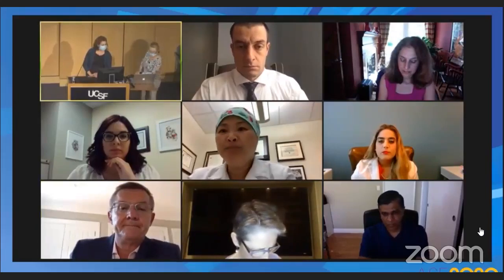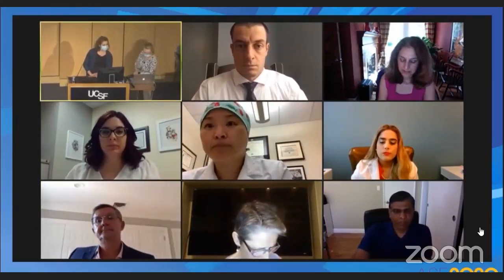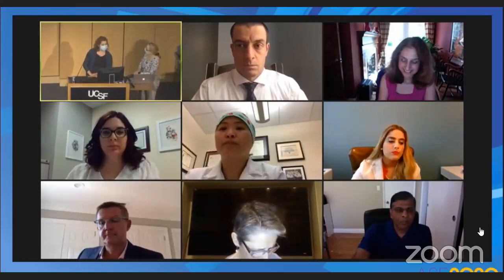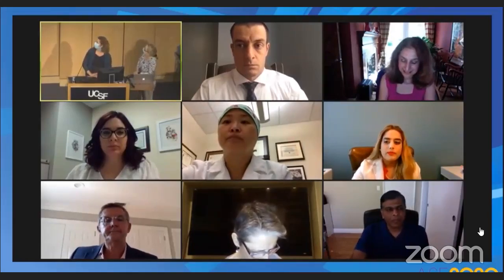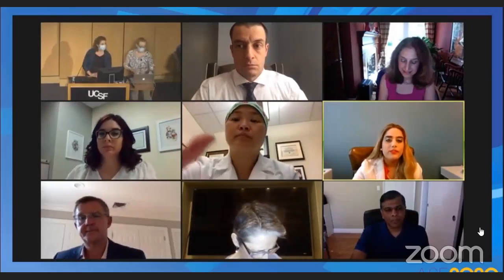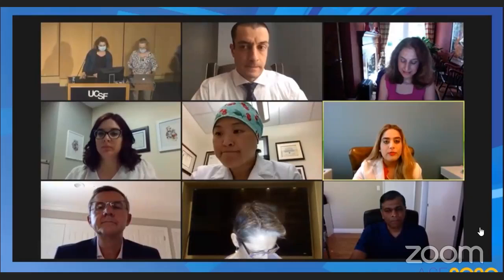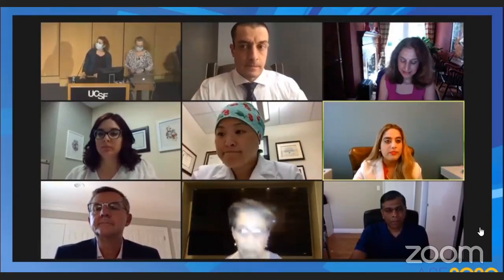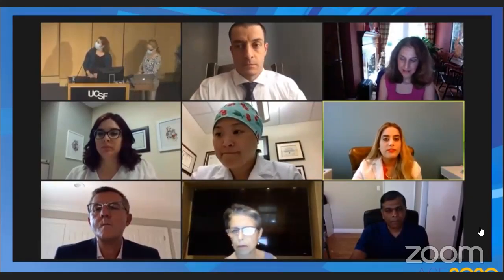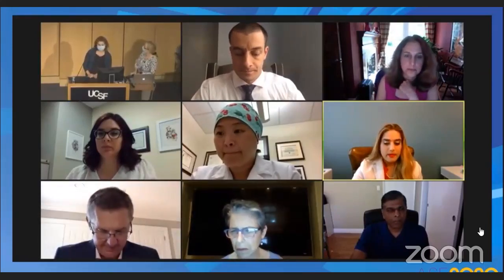Okay. Thank you. We have an audience question that is asking if POCUS is billable. Dr. Raza, could you enlighten us on this, please? Yeah, it's a good question. I think it definitely depends on each individual institution. In some situations, it's billed as an adjunct to a more extended physical examination, particularly if it's being used for a very targeted indication or complaint or symptom.